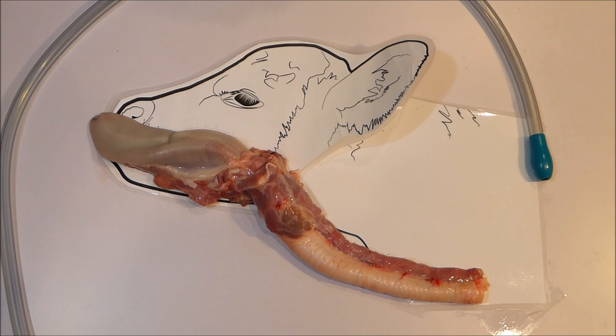So that is our first point: gentle handling, gentle hands and not forcing the nose up will ensure the tube avoids the airway.